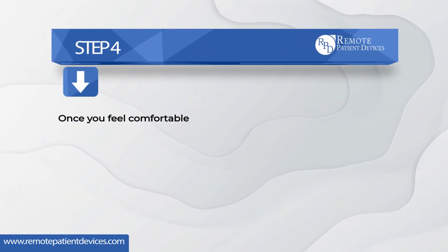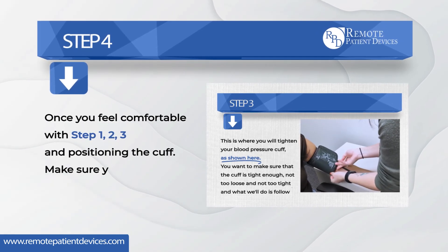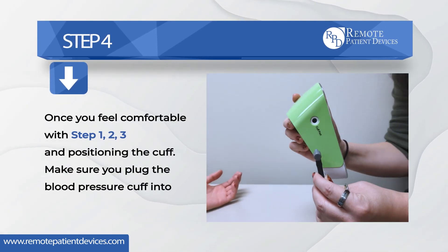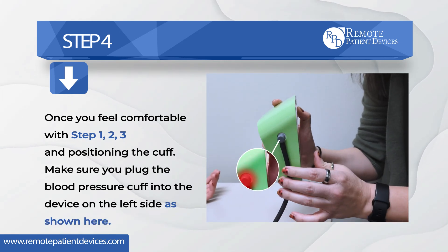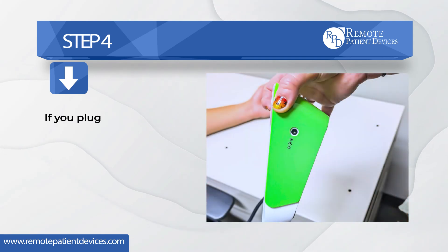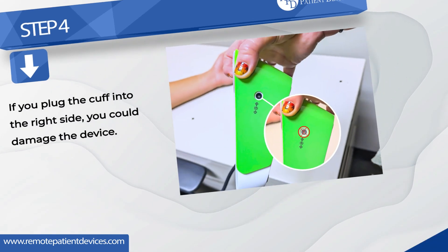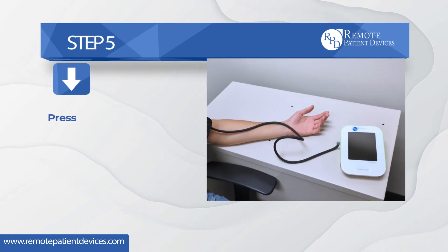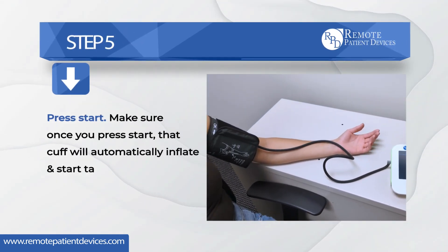Once you feel comfortable with steps one through three and positioning the cuff, make sure you plug the blood pressure cuff into the device on the left side as shown here. If you plug the cuff into the right side, you could damage the device. Step five — press start. Once you press start, the cuff will automatically inflate and begin taking your blood pressure.